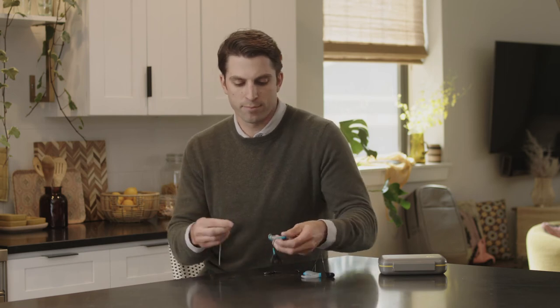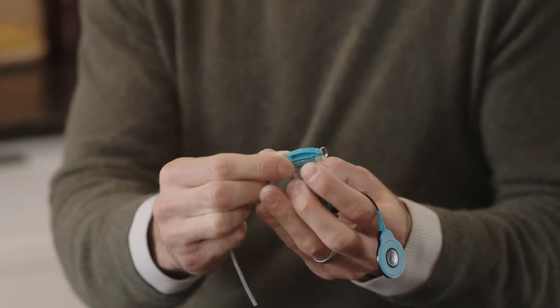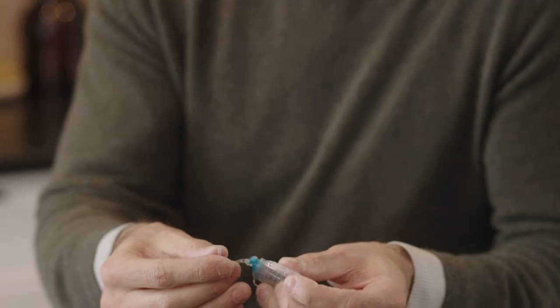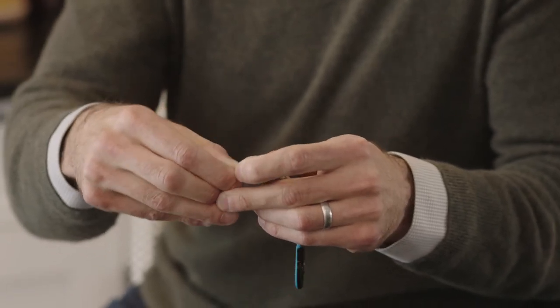You can also use the mic lock stirrup with or without the safety line. Snap the stirrup into place in the dimples at the base of the Aqua Plus. Find the right length of tubing to hold the Aqua Plus in place comfortably behind your ear, and cut the tubing to the required length.